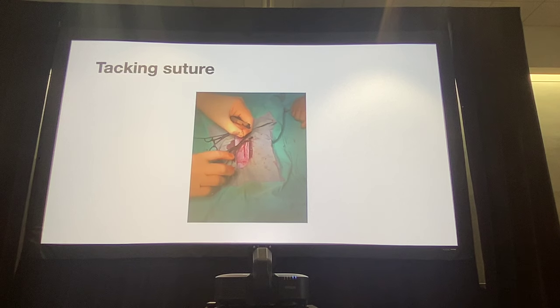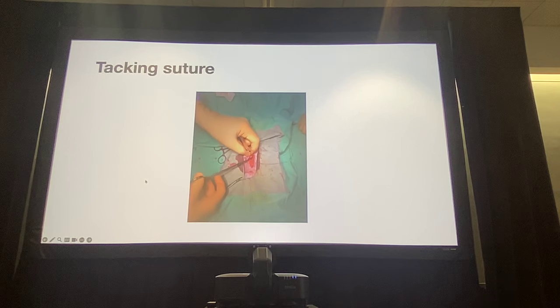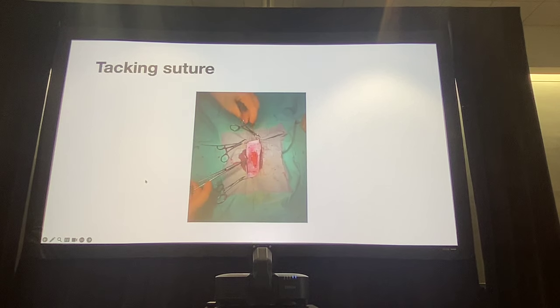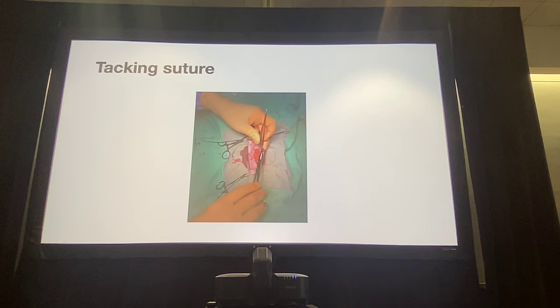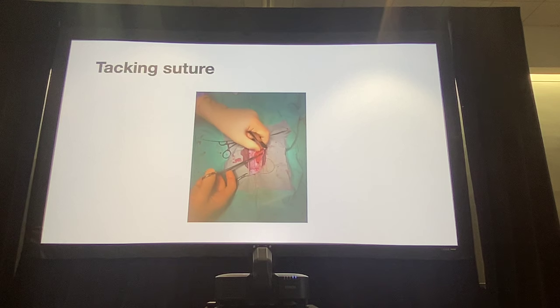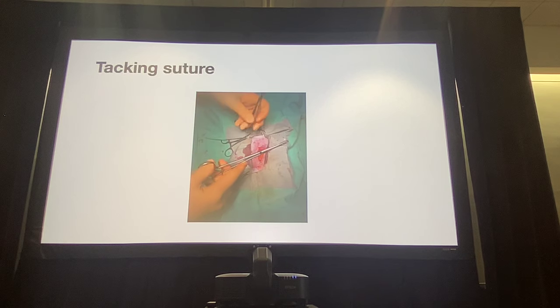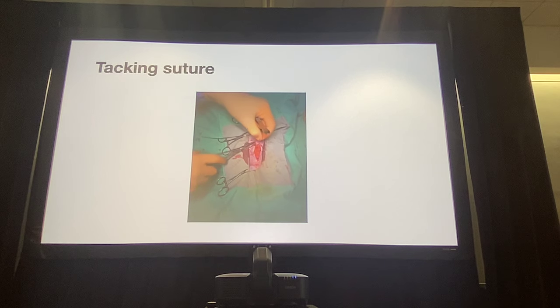Play it again. It's tough on these because you want more of a gap, but that's why that last incision might be the best one for this. There's more room there, so we play it. What I would do with this, because they're doing a subcuticular pattern here, which we're not going to go over, is maybe just start off like a simple continuous pattern. Take a bite on one side of the skin, go into the meat, take a bite on the other side, and tie it. It's the easiest way to learn about tacking sutures.